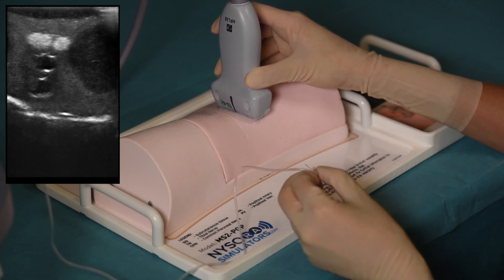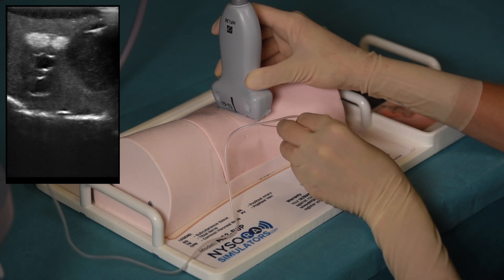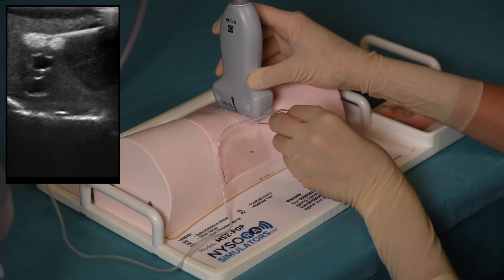In addition, this simulator can also be used to perform an IPAC block, a procedure described in the instructions for use that accompany the simulator. The instructions can also be downloaded at medexpress.pro.